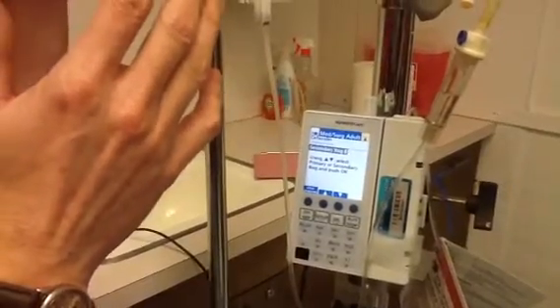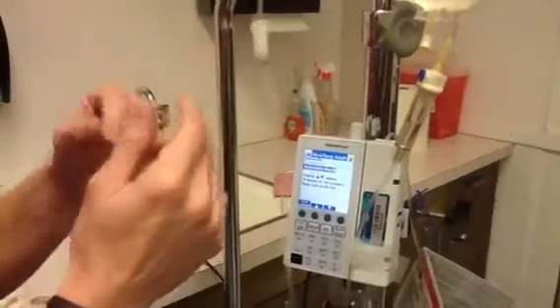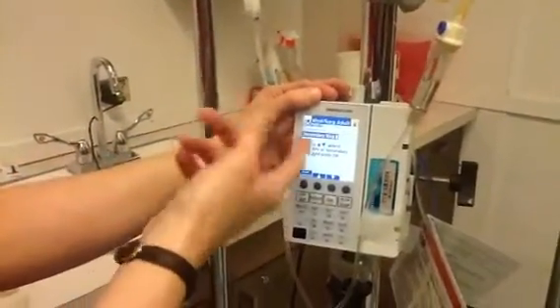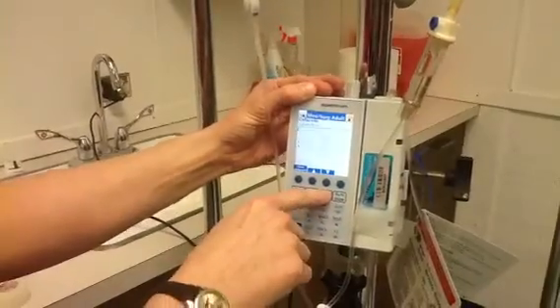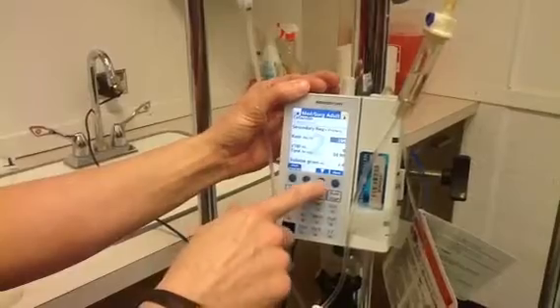The other thing I want to do before I actually even start all this is I want to make sure that my medication I'm going to give is compatible with my primary bag. That would be my very first step. So, this is my secondary bag. Yes. OK. It already has the rate per mil in there. I think that's great. That's what I want to use.